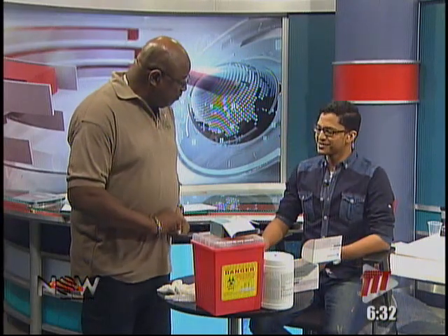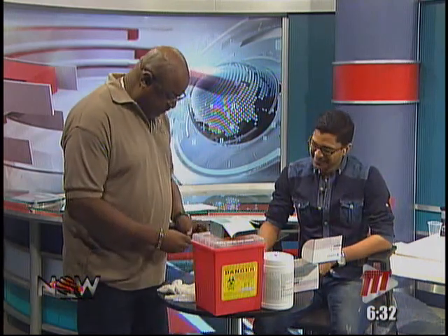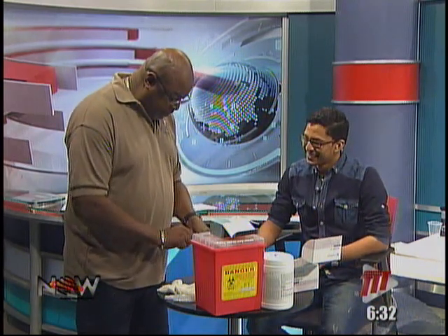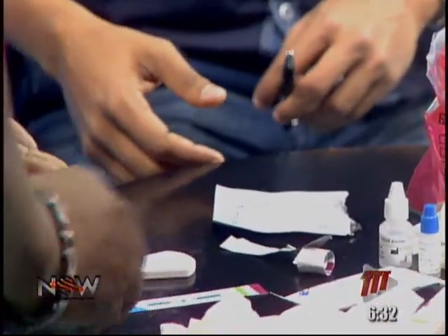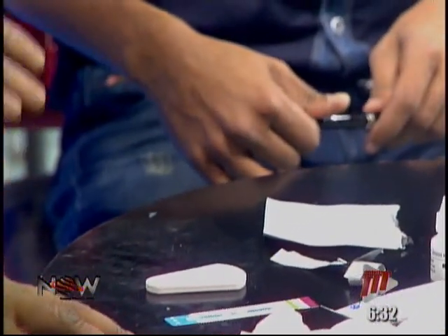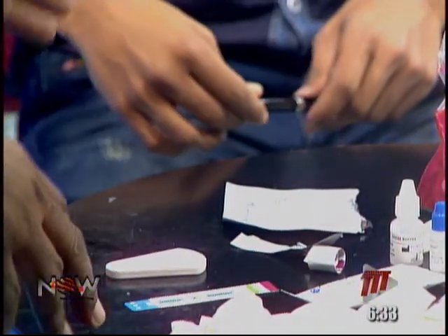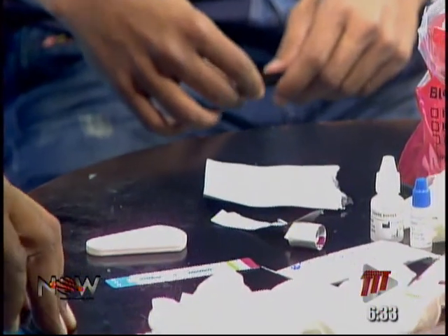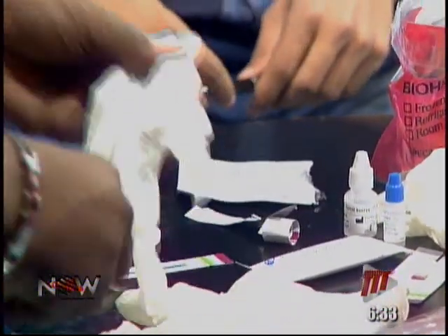I'm not very nervous. I think I've been a good child. First, we would explain to the person what the test is all about, which is the detection of HIV antibodies in the blood. It's a simplified version of the ELISA test, which detects HIV antibodies in the blood.